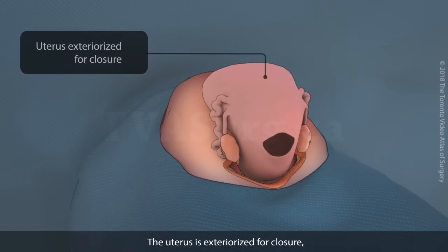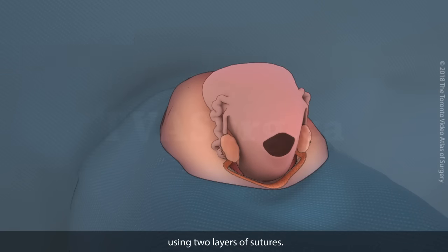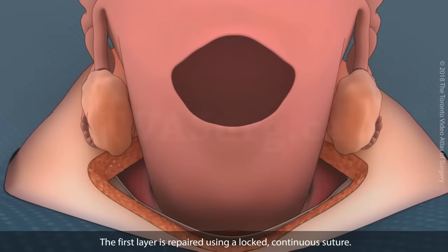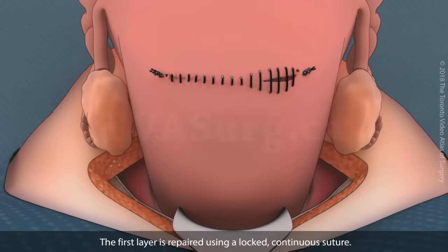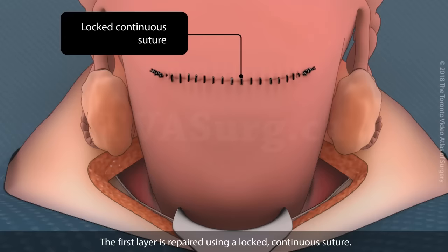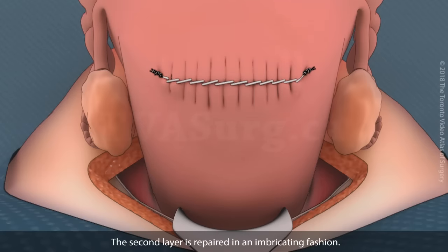The uterus is exteriorized for closure using two layers of sutures. The first layer is repaired using a locked, continuous suture. The second layer is repaired in an imbricating fashion.